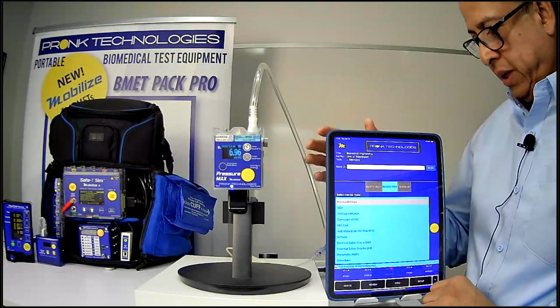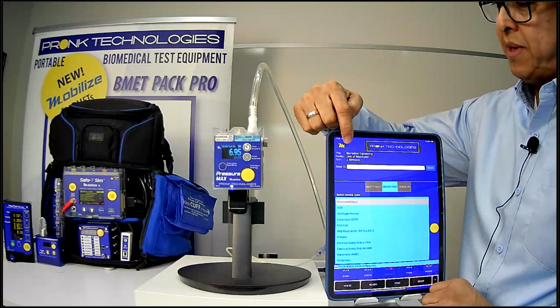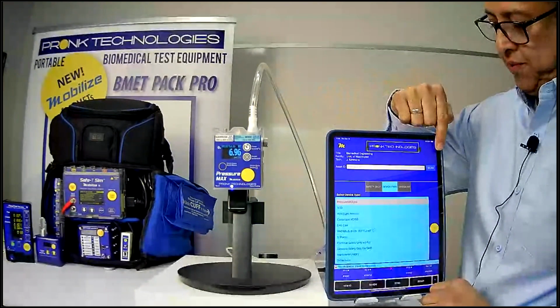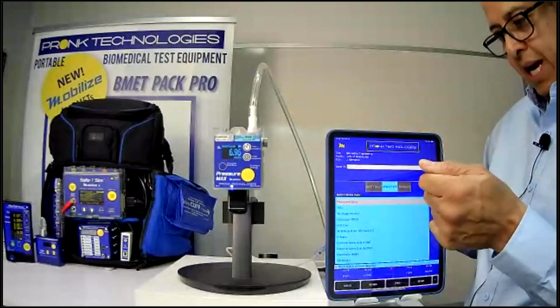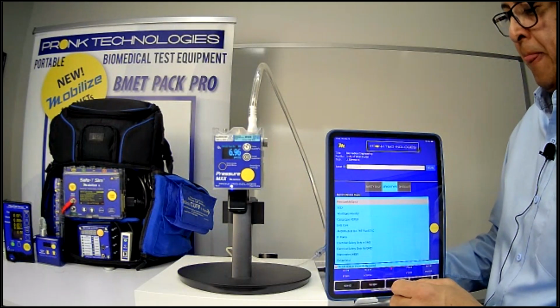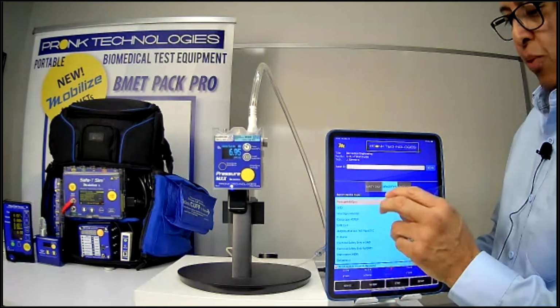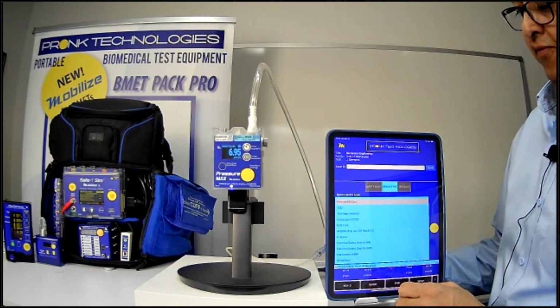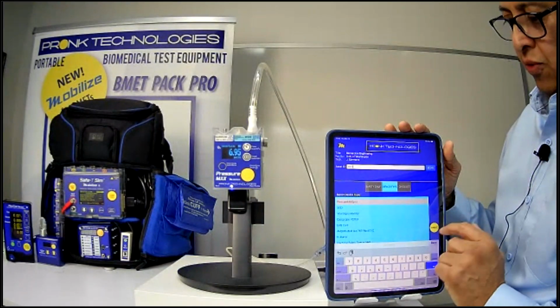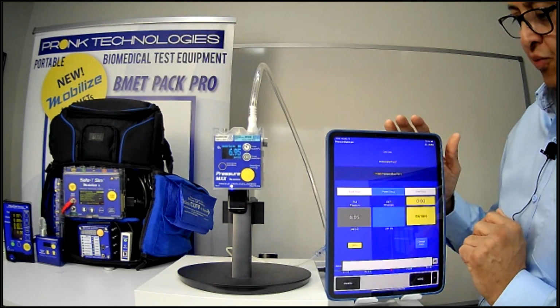So just a quick overview of the app itself. You have the ability to customize the header information here at the top in the setup menu. You can enter in an asset ID, or you can use the scan function to scan the barcode on the medical device to enter that asset ID into the report. And then you have the ability to pick a sequence of protocols that you've designed under the app itself. So I'm going to go ahead and enter in an asset ID here that we'll create. And I'm just going to select Pressure Max here so you can kind of see how this would work.